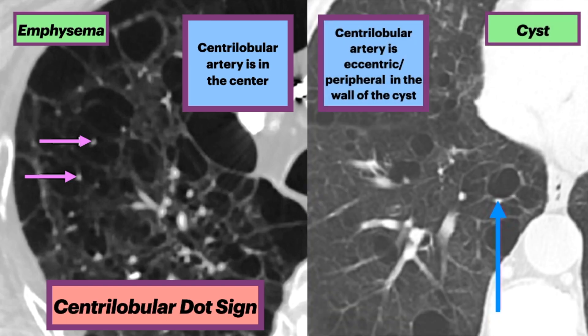Distinguished from the cyst on the right, note how the centrolobular artery is eccentric or peripheral in the wall of the cyst. Cysts also have thin, but sometimes perceptible walls, unlike emphysema.